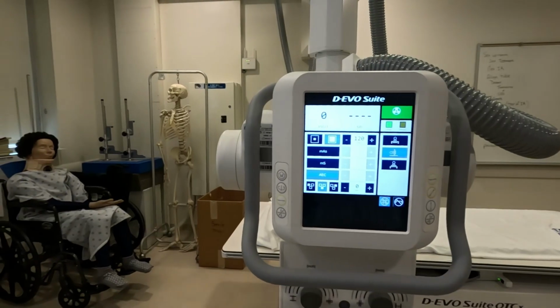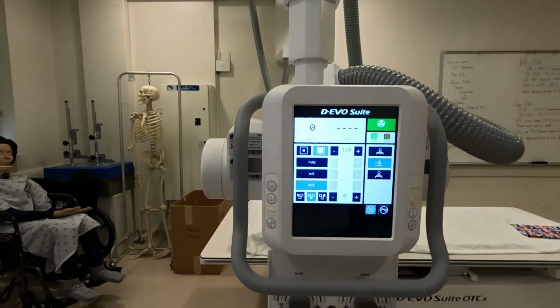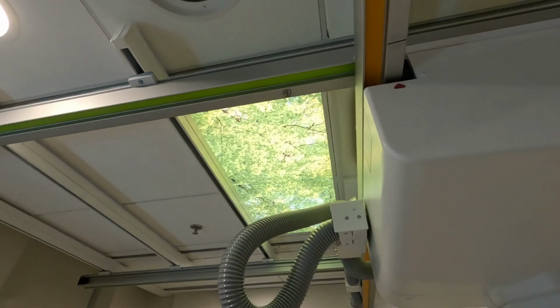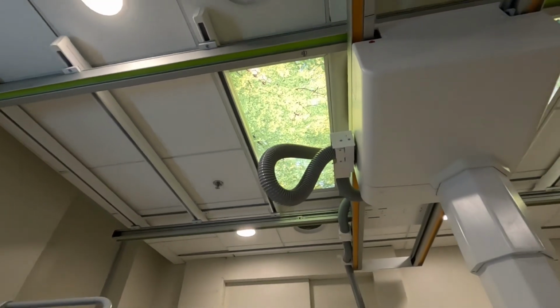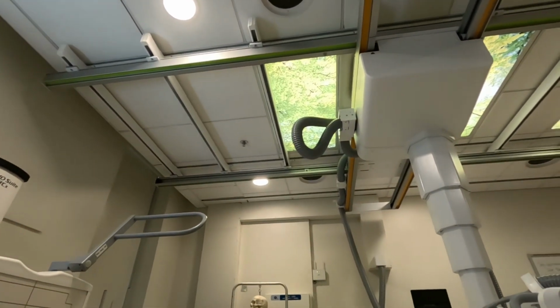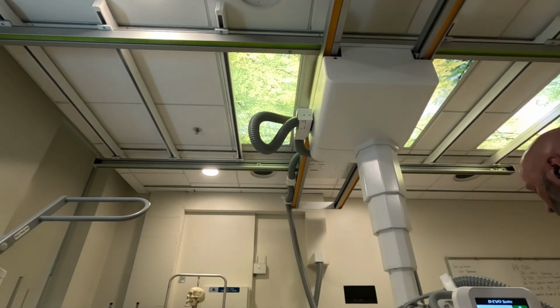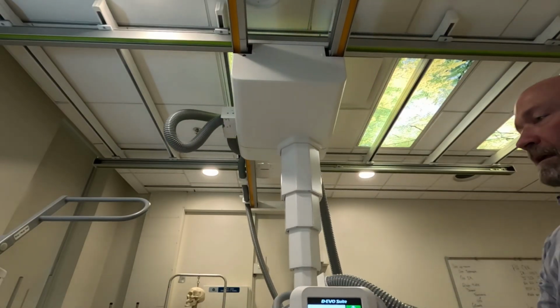There are times when we have the patient upright for maybe an abdomen that we want to shoot at 40 inches. And what we'll do then, I'll pick you up again, and hopefully you can see where it says 40 there. So if we're shooting an upright abdomen, we don't want to shoot at 72 inches because that's hard on the X-ray table. So what we'll do is we'll move our X-ray tube to 40 inches.